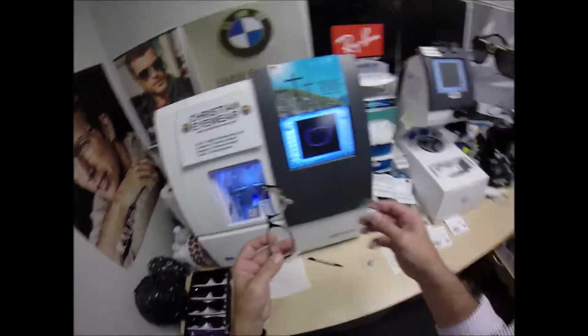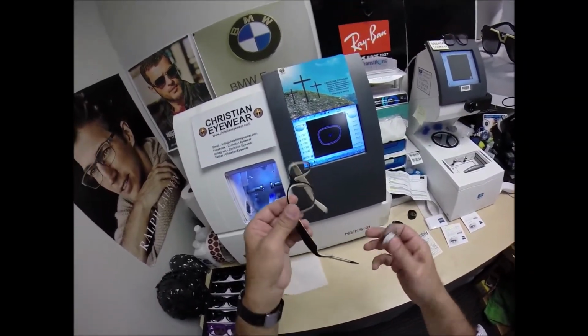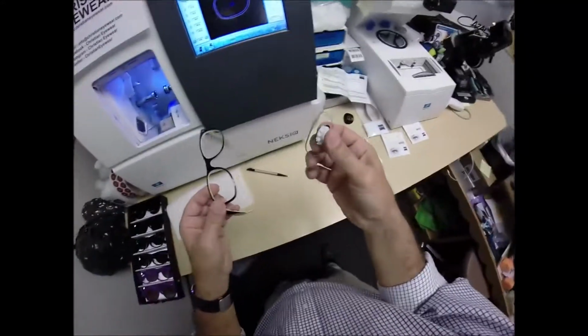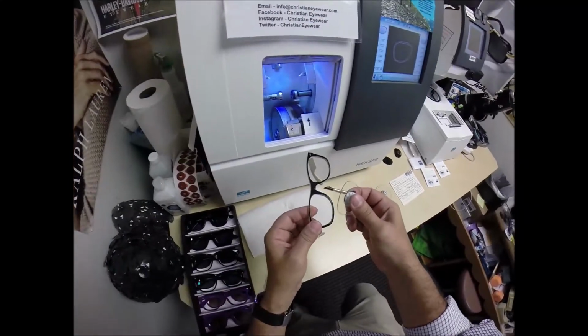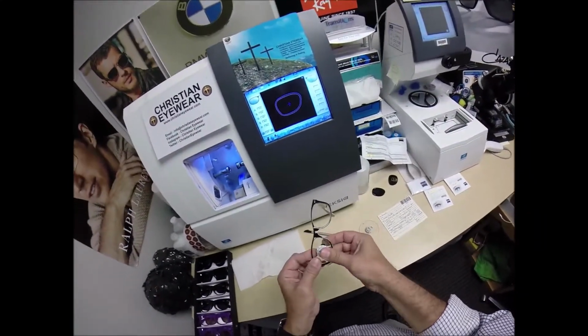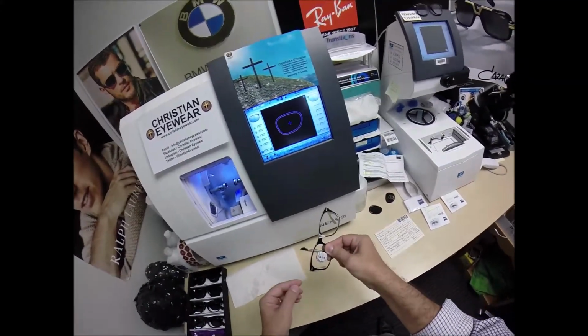You're all I've got. So, years from now, should you ever need new lenses, you have the temples pointing downward, the frames pointing upward. Elbows at your sides, arms bent at a right angle. Stand on one leg, stick your tongue out the side of your mouth. No, okay, feet planted on the floor. Tuck the lens in at the outside corners. Push down with the thumbs, it snaps right in.